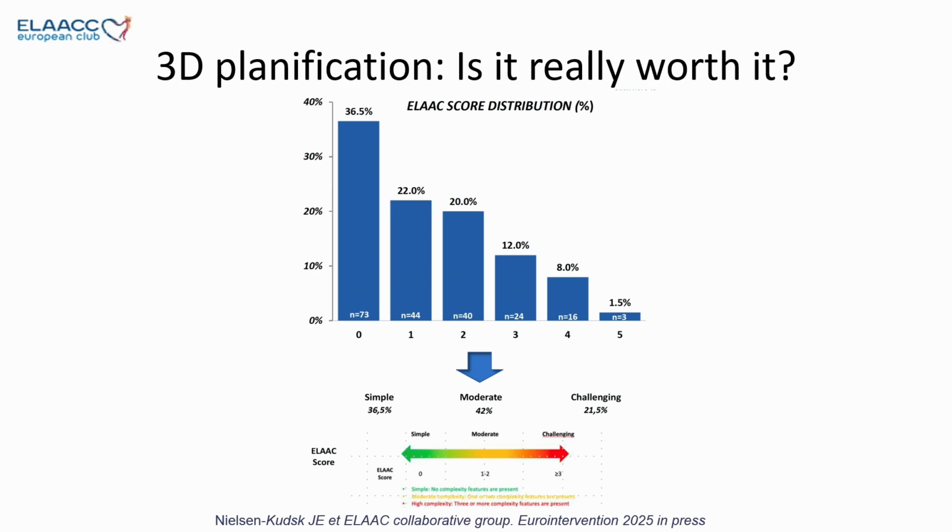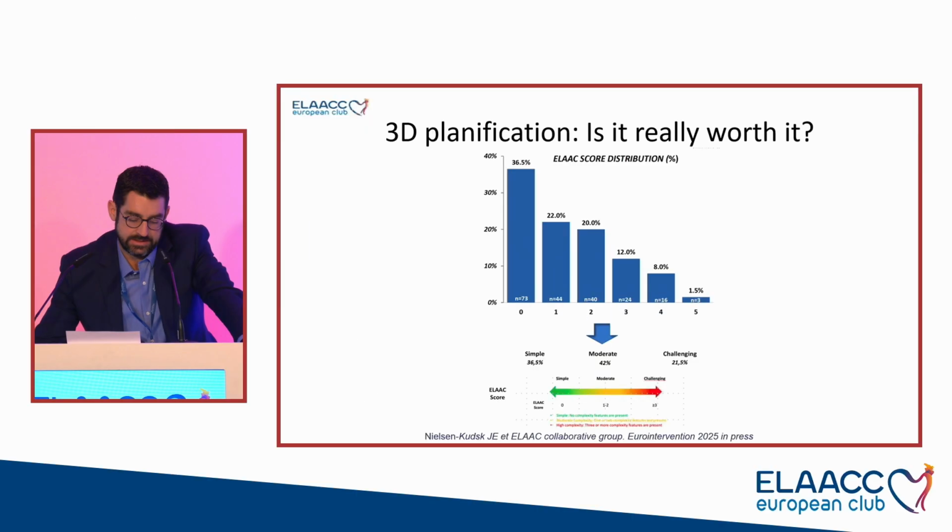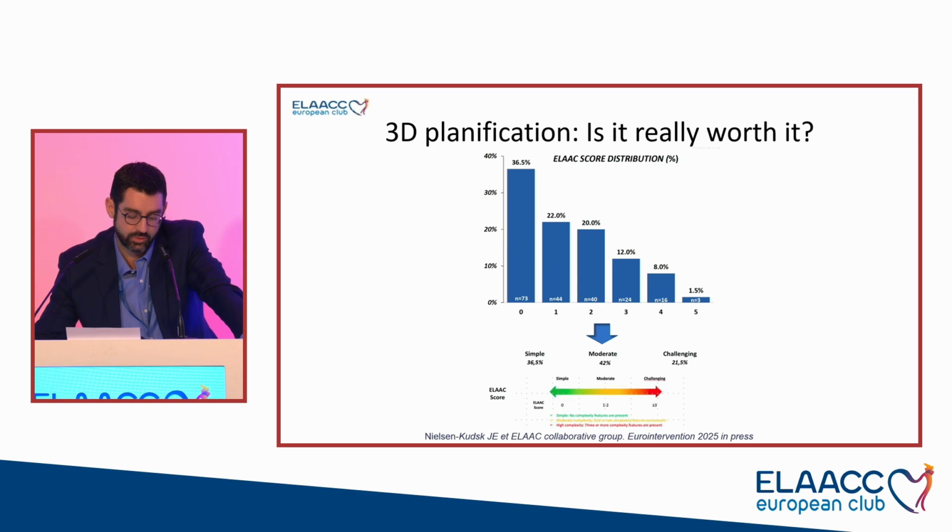So is it really worth it at the end? If we look at the EuroIntervention paper and the distribution of the complexity in terms of anatomy, you can see, and you already saw this diagram yesterday, that we mostly deal with quite simple LAAs.